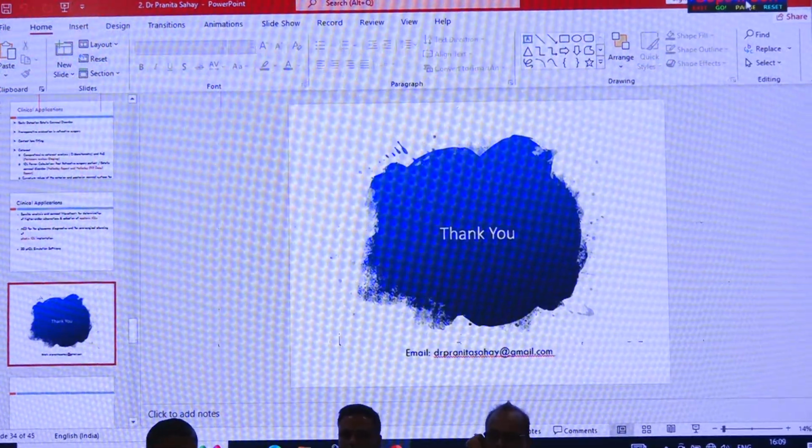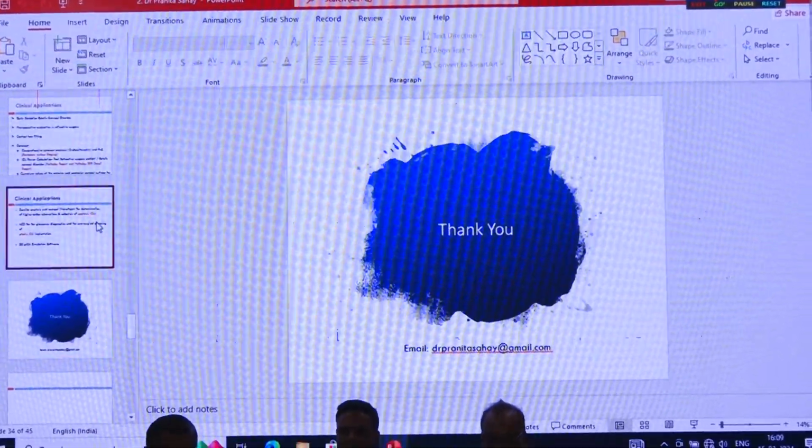So what is the take-home message, especially for people who are not too much used to corneal topography readings? The take-home message is at least you should be able to understand the 4-quad map, so that once a patient comes with you with a map and you see hot colors, red colors, you should be able to identify, yes, the topography is not normal. And at least keratoconus is something that you should be able to pick up, wherein you should see whether the steepening, thinning and elevation, all if are corresponding to each other. That means you're looking at an ectatic cornea.